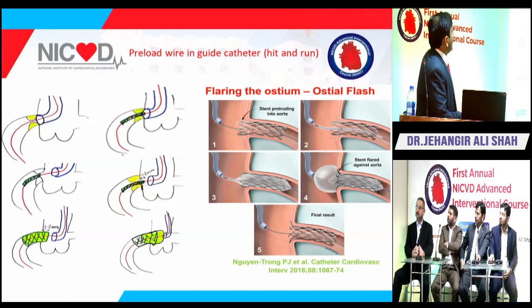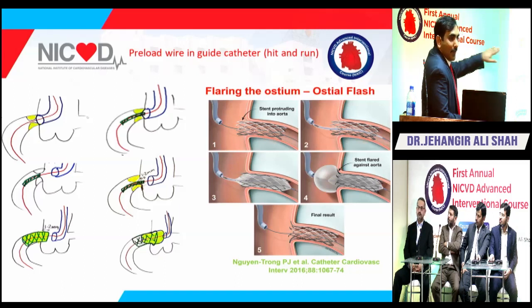like preparation of the ostium by using a higher pressure balloon or atherectomy. As we already discussed, these are all the hit and run technique. As Dr. Abdul Hakim said, you just cross the stent accordingly and deep your guide. This is the technique. Then pull your guide out with the double hand technique and confirm your position with the dye through this guide and inflate it, and try to flare the ostium through the same balloon, the balloon flaring technique.